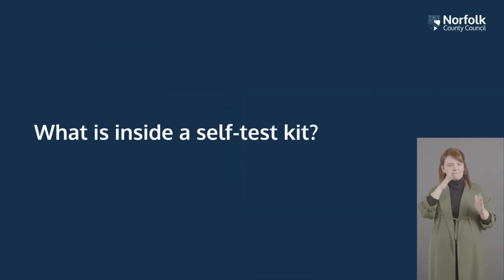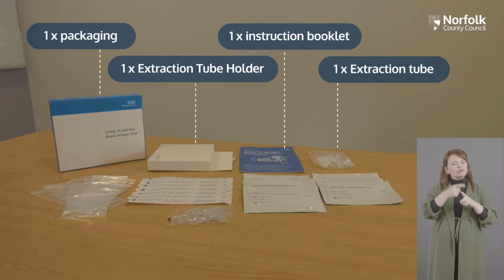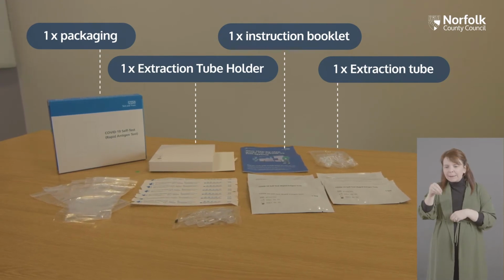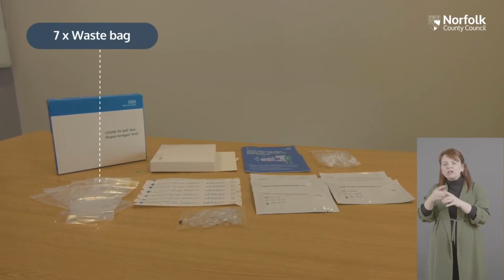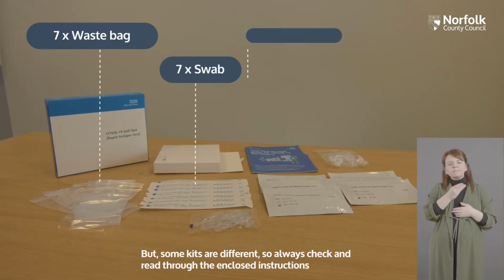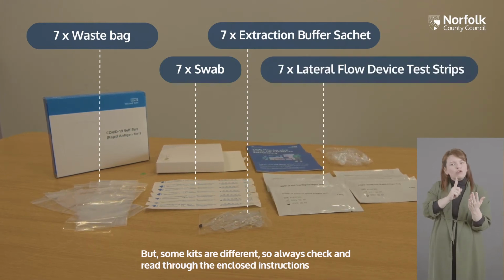What is inside a self-test kit? The NHS Test and Trace self-test kit contains packaging, extraction tube holder, instruction booklet, extraction tubes, waste bags, swabs, lateral flow device test strips, extraction buffer sachets, but some kits are different, so always check and read through the enclosed instructions.